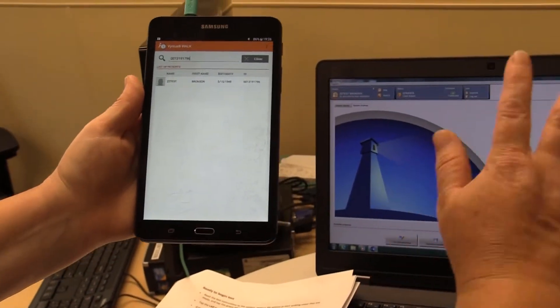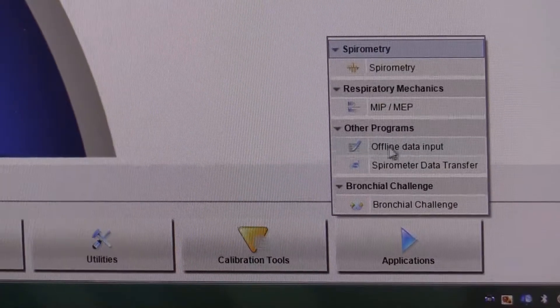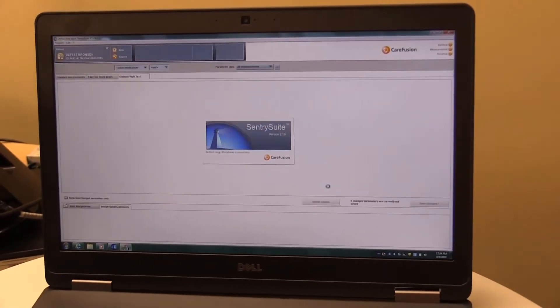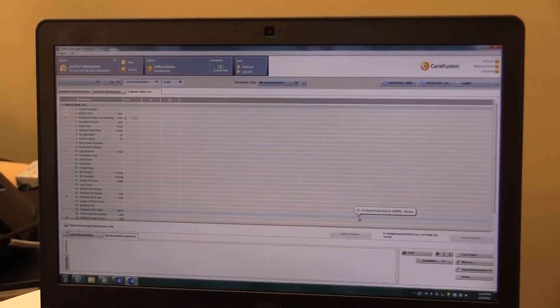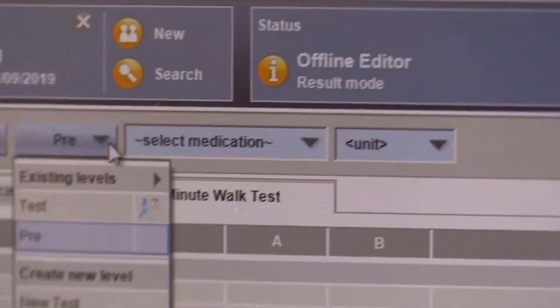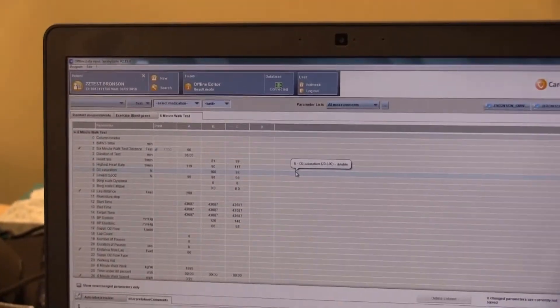My data has been transferred successfully. Then I can come to the computer, go down to applications, and click offline data import. This is going to create the report for us. Once we do that, you see the six-minute walk test report. If I go up here from pre, I have to change this to test, and that will help start importing your testing data right from the tablet.